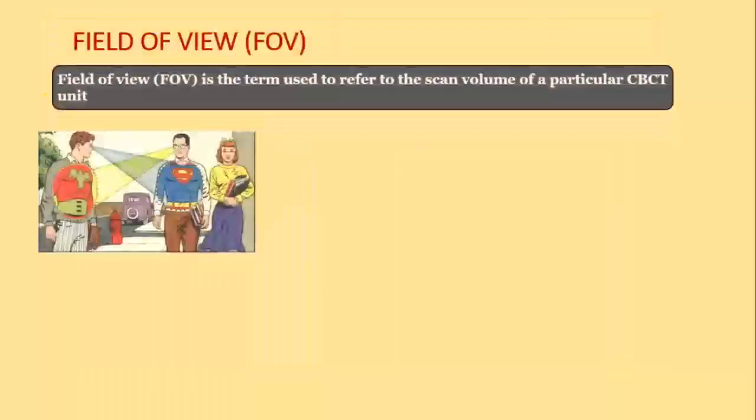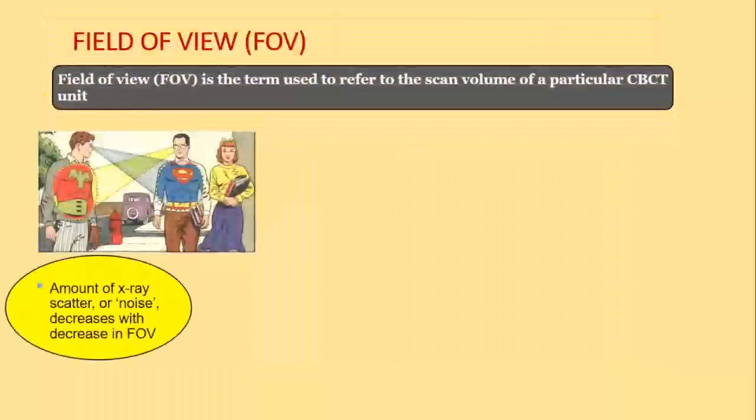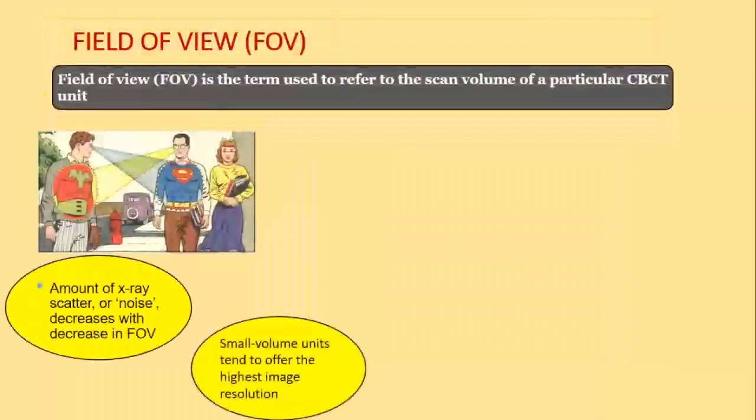So the concept of field of view, many of you must be aware, but just to let you know, when I say field of view, I'm just trying to say, what do I see?